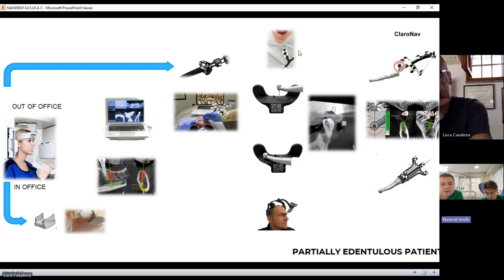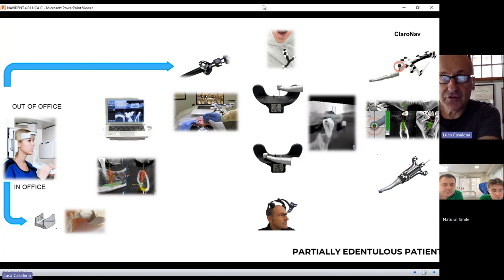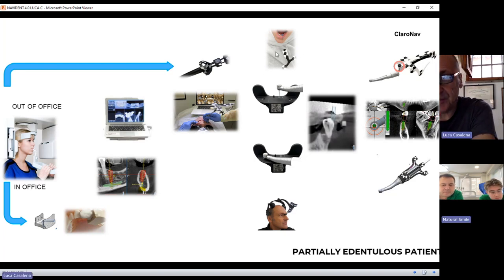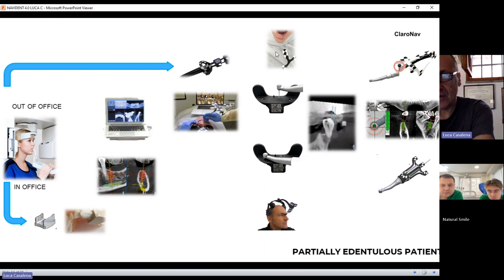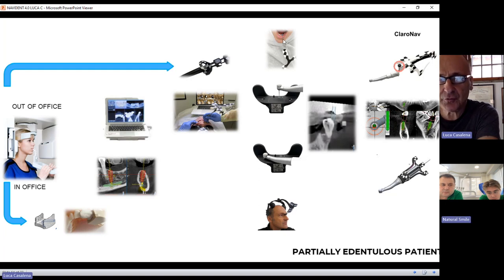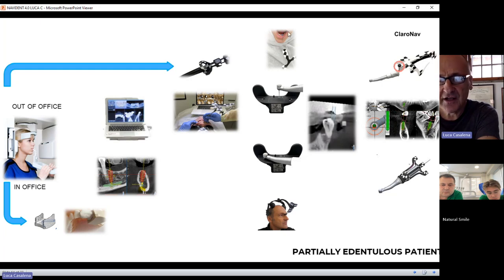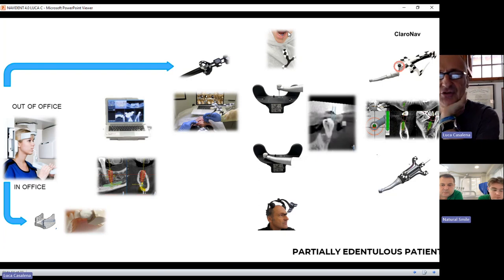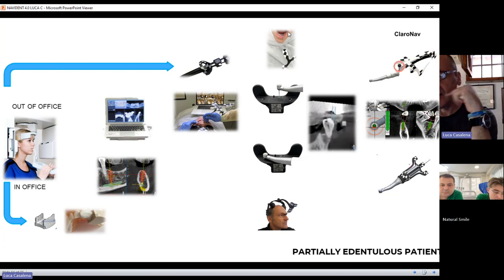For our patient, do we put the optical target on the right side or the left side? You want to put the optical target not on the site of surgery. If you need to operate on the third and fourth quadrant, you want to place it in the center — but since you're going to be operating there, you need easy access on the rear of the jaw.